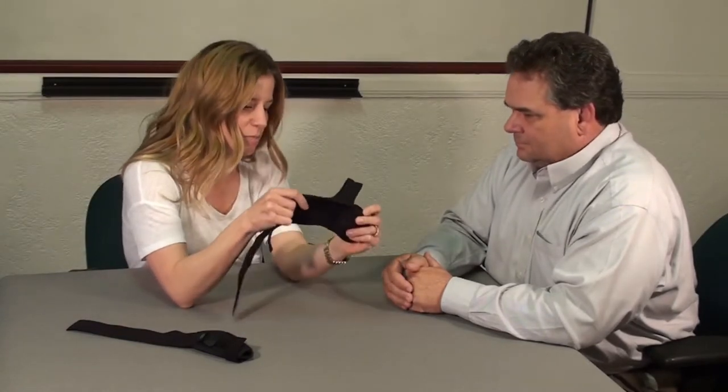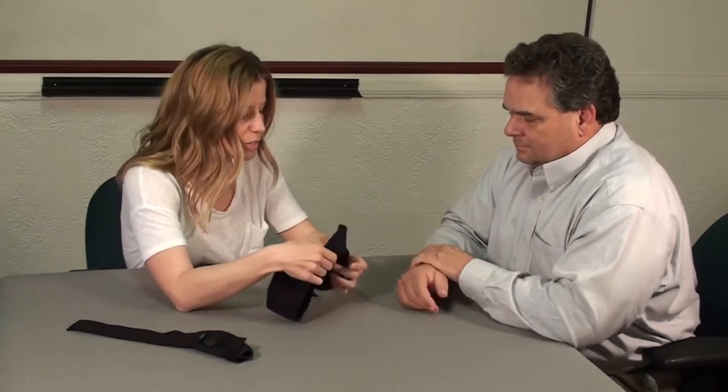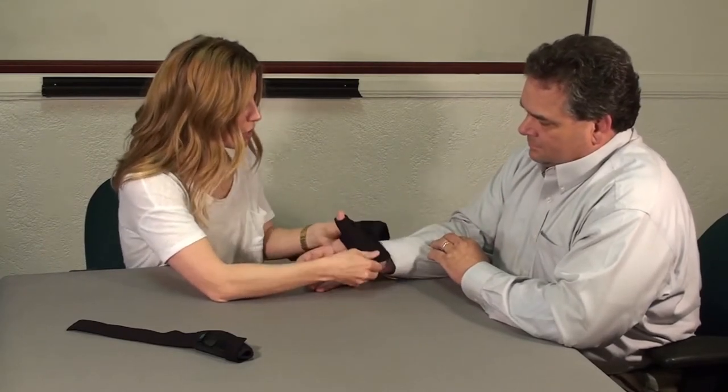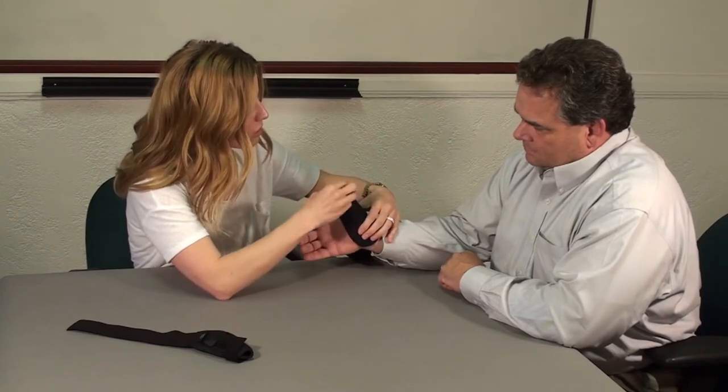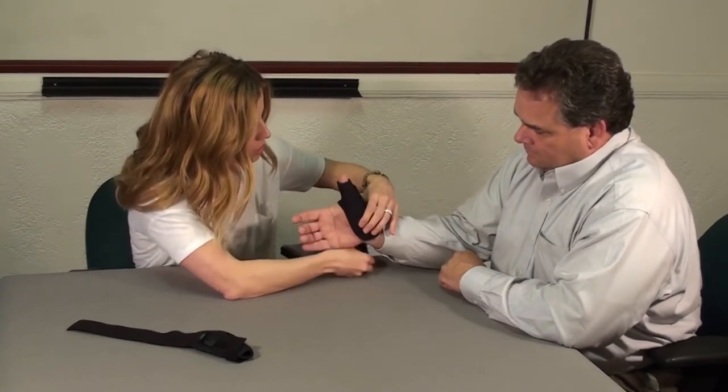This is what we call our MODAB thumb splint. You can see it's made out of a perforated neoprene — you can kind of see through it — so it's nice and cool. I'm going to slip your thumb in there. You'll notice it's long on your thumb, but not to worry, because this is trimmable. The construction allows for the IP to be trimmed, which is a nice feature.